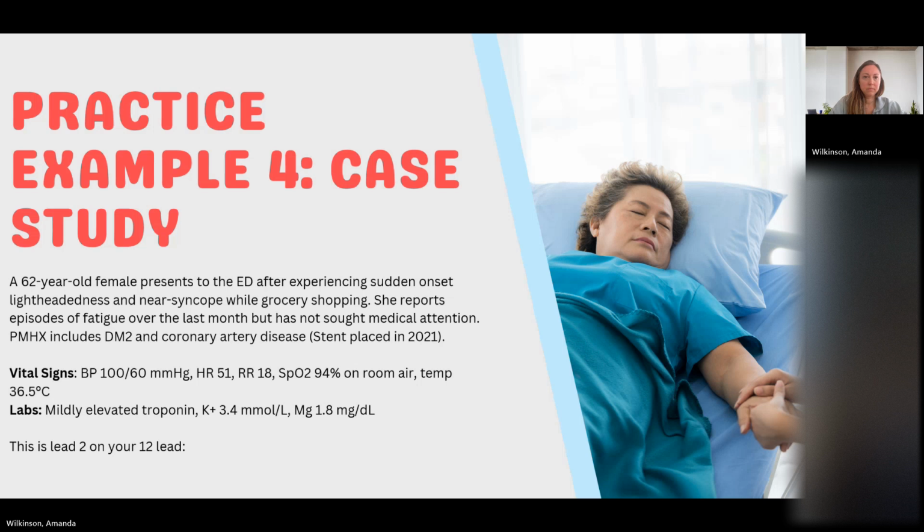When we get to 12 leads, you also look at V6, which we are going to talk about 3 sessions from now. But for your continuous cardiac monitoring, we look at the V lead. Okay. Thank you. You're welcome.